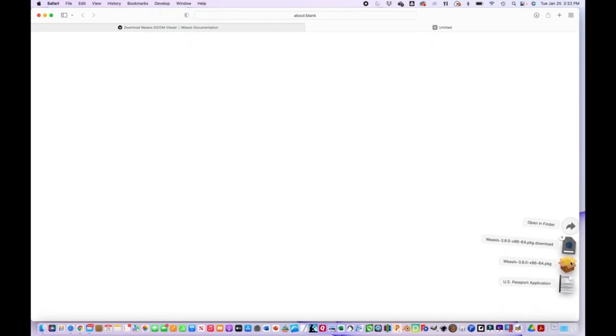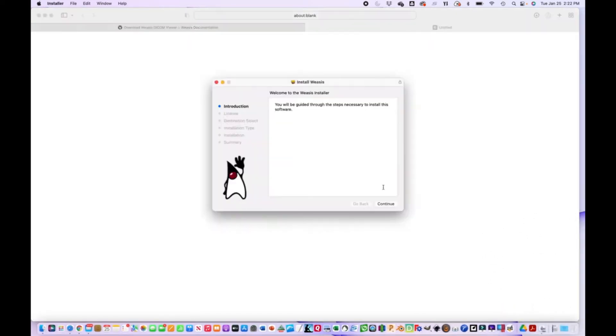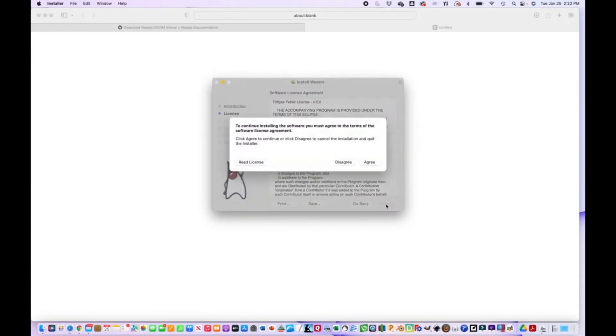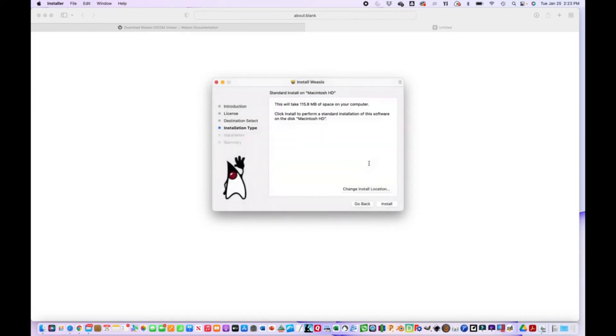Click on the package once it downloads and just follow the prompts. It's super easy. Continue, and you're going to agree to this license agreement. Make sure that it's the proper location for install, usually it's Macintosh HD.